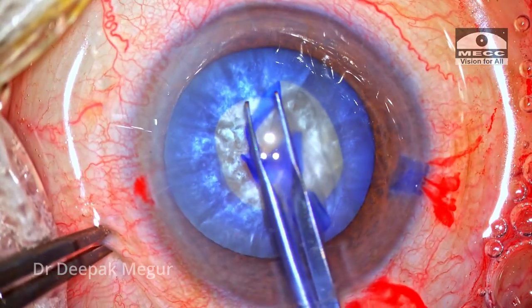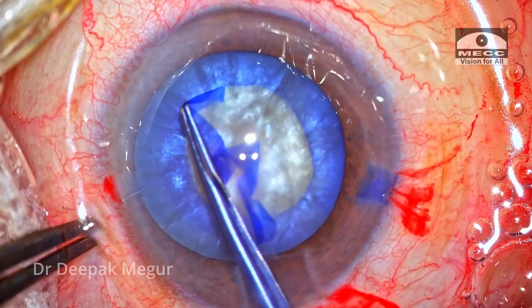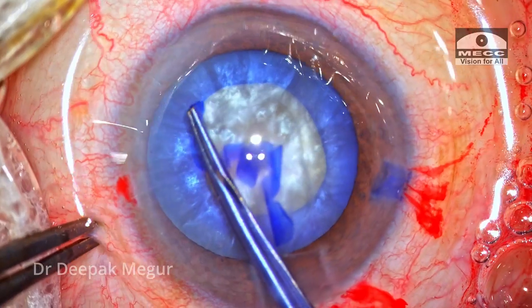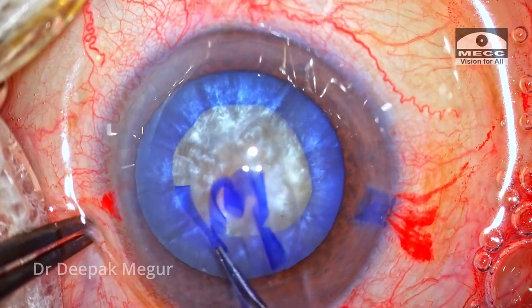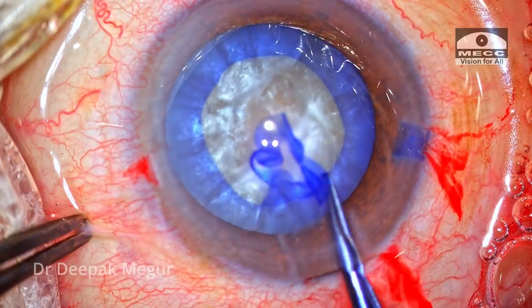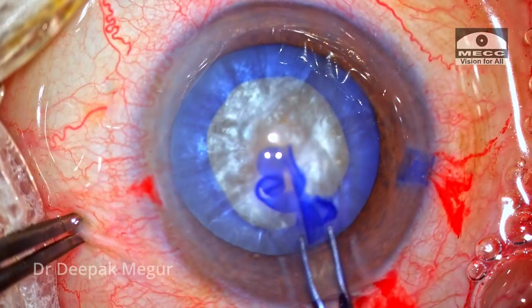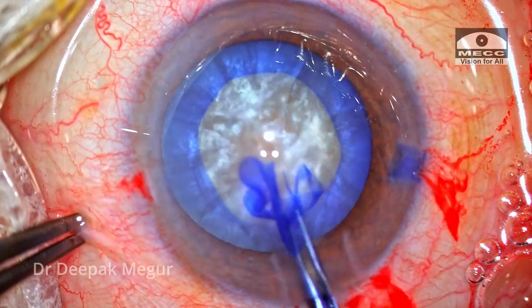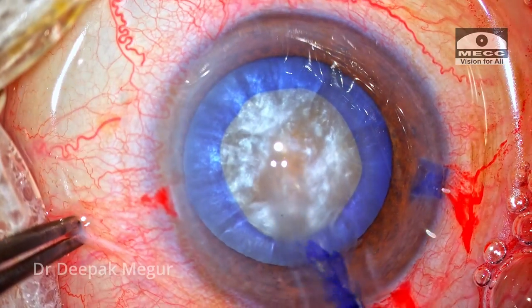This decision is taken intraoperatively once I feel confident that the capsule is behaving well and the chamber is well maintained. It's much easier to control the tear of a very thin flap compared to a slightly bigger flap. As we can see, the rhexis is very well under control and I could achieve a decent-sized, about four and a half to five millimeter rhexis.